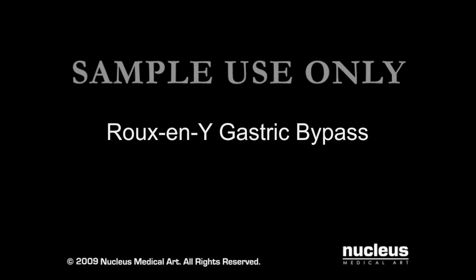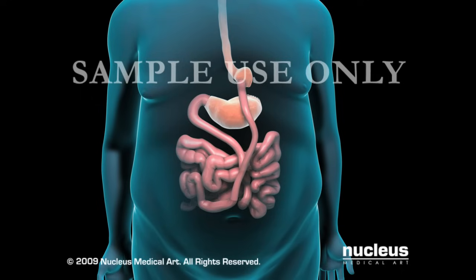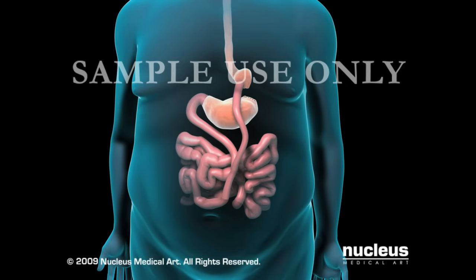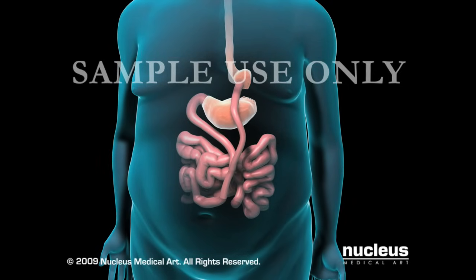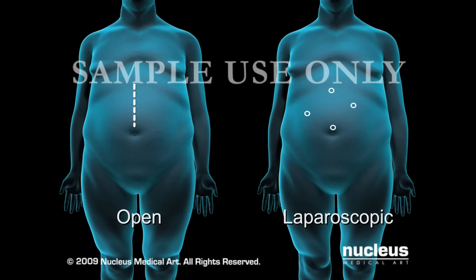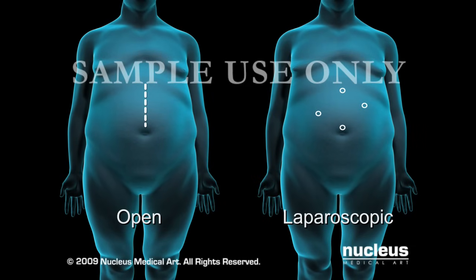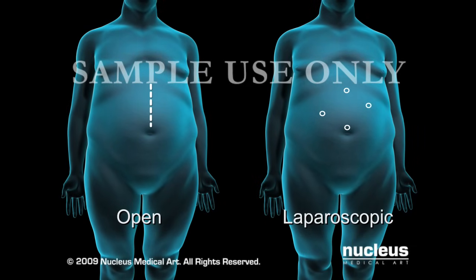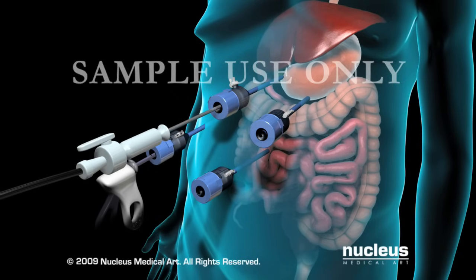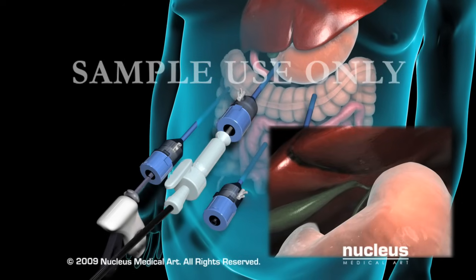Gastric bypass, technically referred to as Roux-en-Y gastric bypass, is both a restrictive and malabsorptive procedure because it reduces the size of the stomach and decreases the absorption of calories in the small intestine. Your surgeon will use one of two methods. The open method requires an 8 to 10 inch incision in the abdomen. The laparoscopic method only requires several small keyhole incisions, through which your surgeon will pass a laparoscope and surgical tools. A laparoscope is a thin, lighted instrument that projects images of the surgery on a monitor in the operating room.